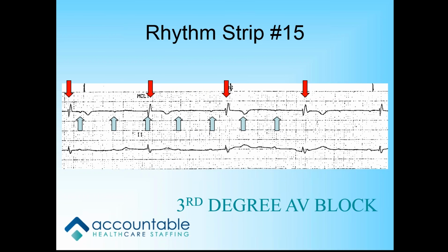When you're looking at your second degree heart block, you have P's for most of your QRSs, but you're going to drop a QRS complex. But your basic underlying rhythm will be a sinus rhythm. It could be slower, but it's going to be an organized rhythm. Got it. Organized. Okay, Kristen, good job. Thank you.